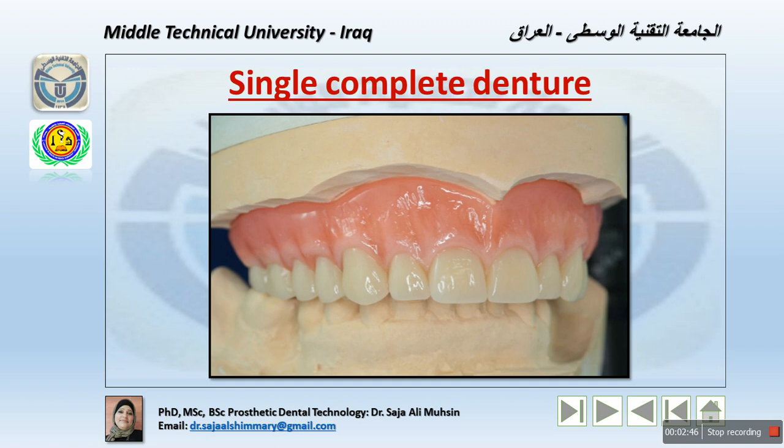So the practitioner or the dentist may be able to overcome the problems associated with a single complete denture by applying many factors. First of all, all fundamental steps in denture construction must be followed and completed to perfection without minor error. Now the occlusal plane of the natural teeth in the opposing arch must be harmonized. So that means probably we need a few modifications.